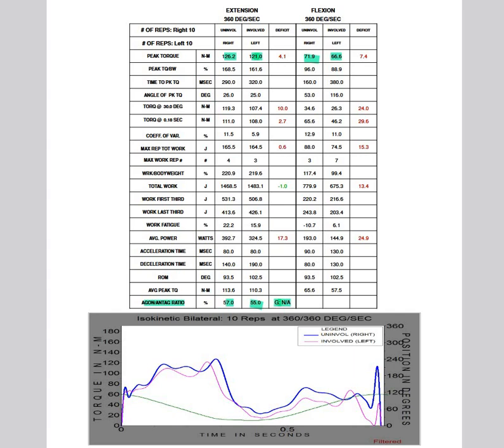He used to joke that if you didn't have your hamstring muscles when you kicked a ball, your leg would just continue to arc forwards and come up and you would most likely kick yourself in the face. Now that's a bit of an exaggeration, but it does indicate the role that the hamstrings play eccentrically during simultaneous hip flexion with knee extension. So because that's the muscle actions that occur during a kicking movement, an eccentric hamstring with a concentric quadriceps, then testing the HQ ratio eccentrically and concentrically is going to be more physiologically relevant.